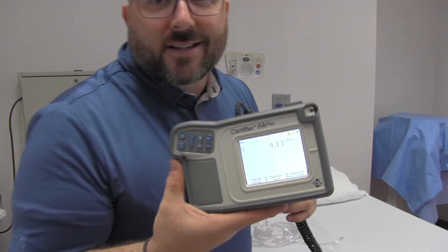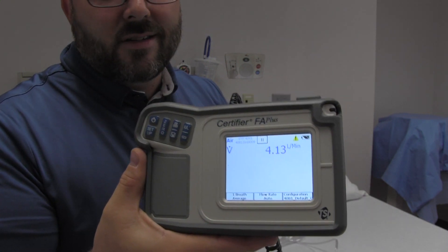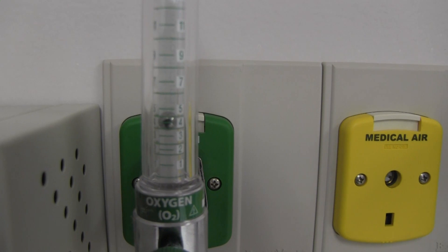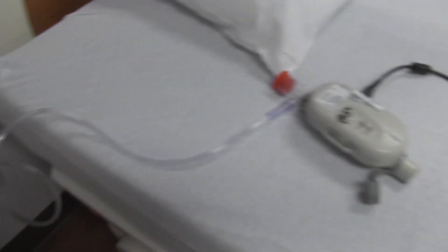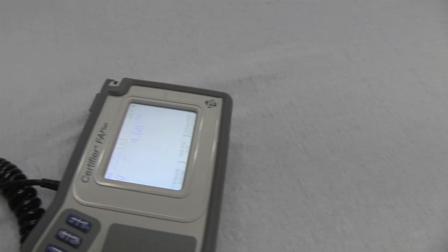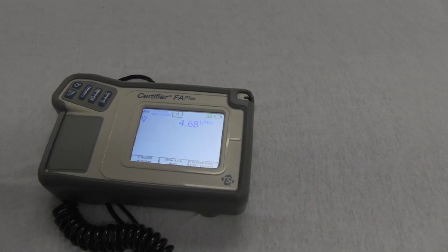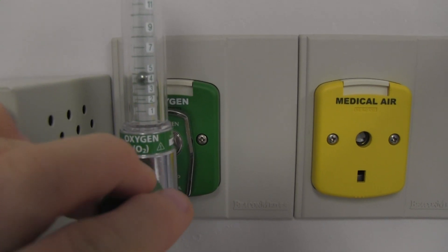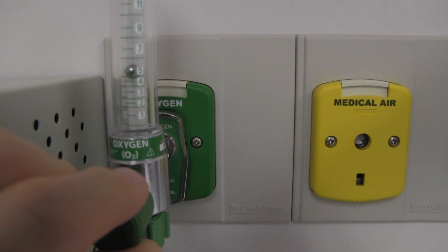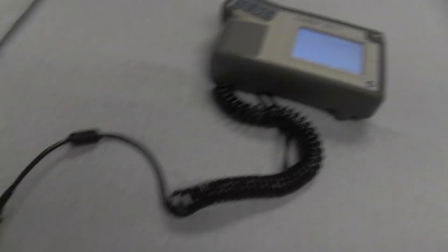I have a device today that will actually measure flow. You can see the flow meter on the wall is set at four liters per minute — the ball is riding right in the center of the four. Following the tubing down to the device, we're reading 4.68. Let's go up to five — the ball is about in the middle, and we're reading 5.61, running just a shade higher than what the flow meter shows.